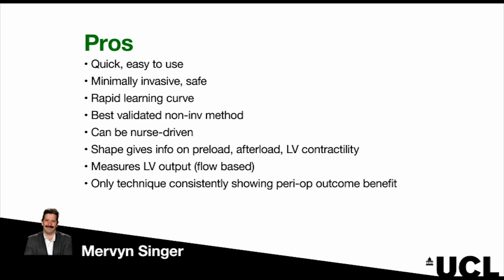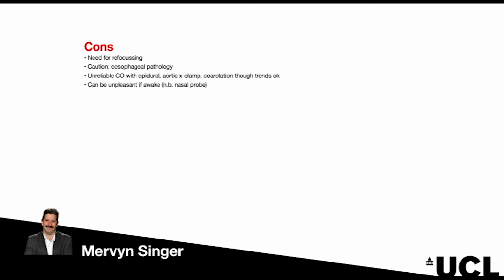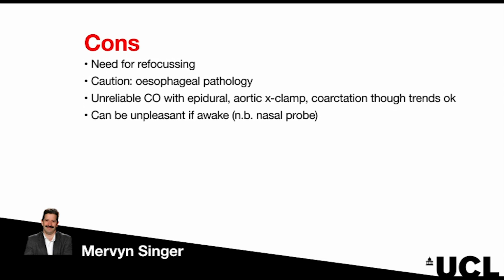So it measures cardiac output by looking at the flow velocity. It's not a derivation, for example, from a pressure waveform. And of all of the different techniques that have been looked at perioperatively, it's the one that's most consistently shown an outcome benefit. Clearly, there are downsides. The probe can move, so you may well need to refocus the probe, but it's easy to recognize, it's generally easy to perform. We use it in patients with varices and so forth, but clearly you have to be cautious in patients with known esophageal pathology.